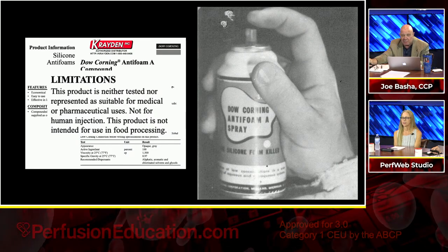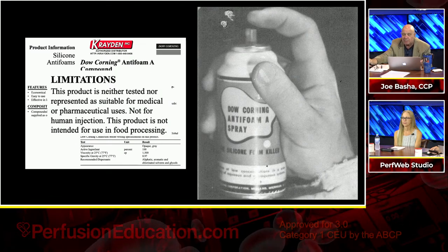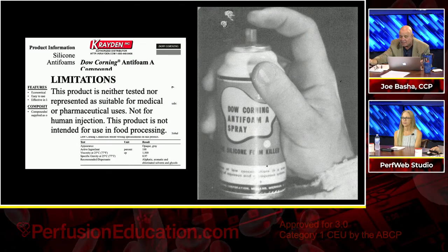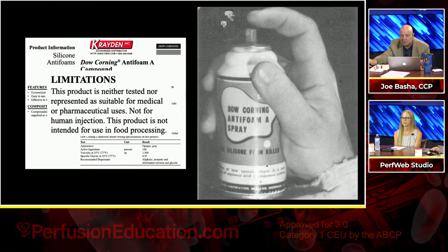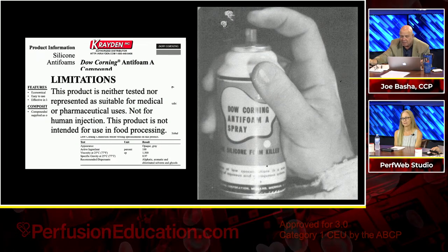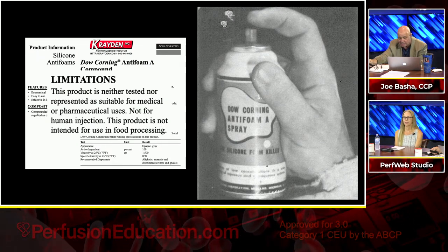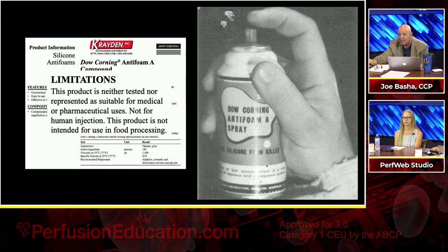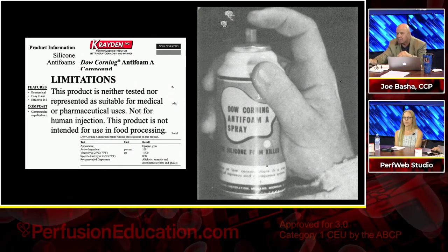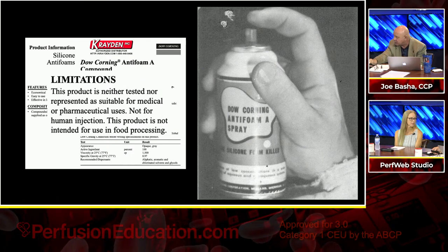So moving on from there, it also says this. This product is neither tested nor represented as suitable for medical or pharmaceutical uses. This product is not intended for use in food processing. So it's interesting that he realized this product existed. They used it for his bubble oxygenator.